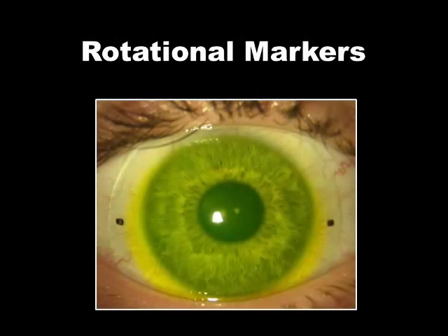Now the one thing that is different is you have these rotation markers in the ICD toric. And although the patient's astigmatism might be 180, you don't know if the actual scleral toricity is flat axis at 180. So the toric ICD trial needs to be placed on eye to determine which axis the lens sits at.